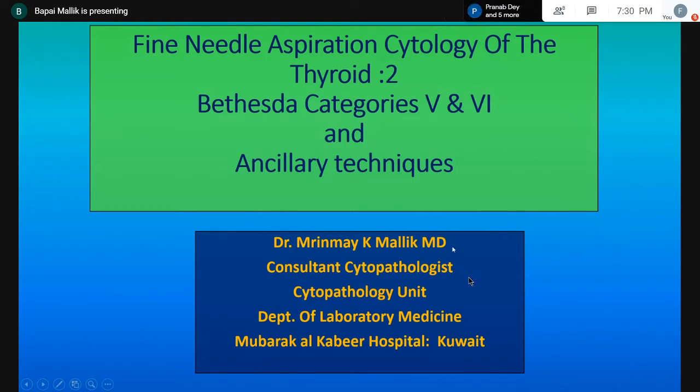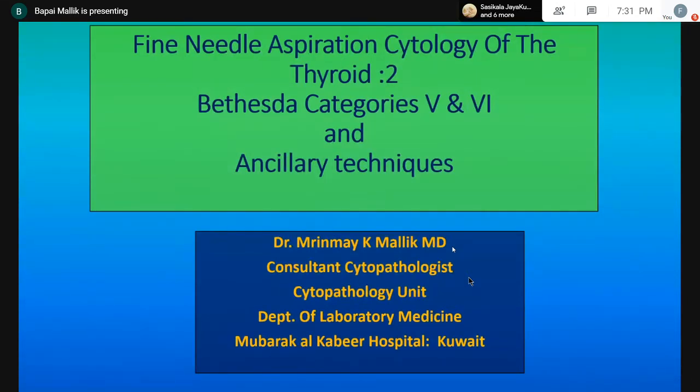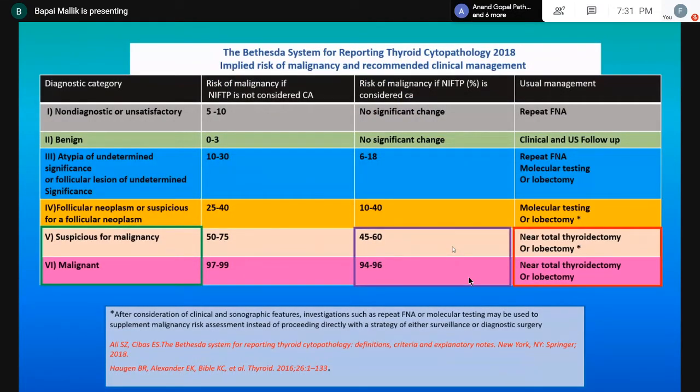Okay. Thank you, Nadeem, as usual, and good evening, everybody. Today I'm going to be talking about the Bethesda categories 5 and 6, which means the categories that are called, in general terms, suspicious for malignancy and the malignant ones. So before we go into them, I would like to just revise the Bethesda system of reporting thyroid cytopathology table. And these are the two parts which are boxes in green, suspicious for malignancy and malignant, which we are going to be talking about today.